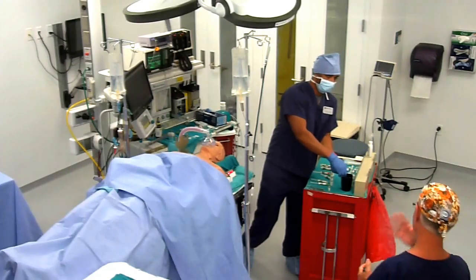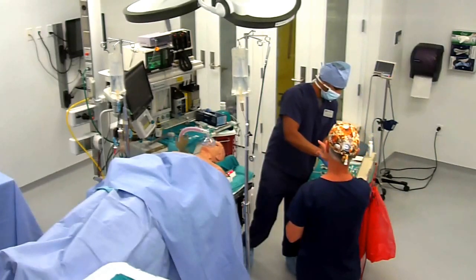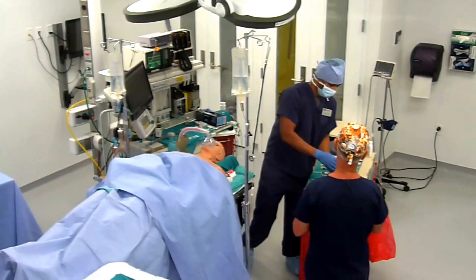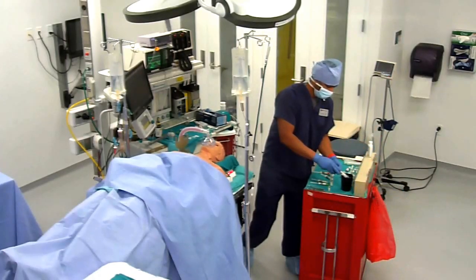But as you're progressing through your induction here, as long as your pressure's okay, you can go ahead and crack on your sevo to 1%, work your way up. Gotcha, even though she's still breathing. As long as you can ventilate her, then go ahead and crack on your sevo is a good way to keep her asleep.